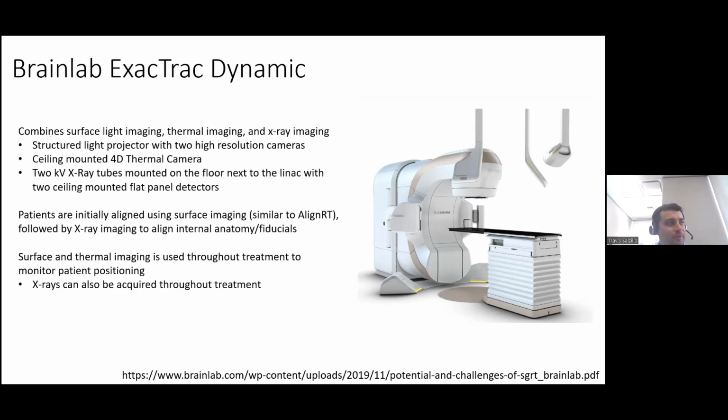There's a few other technical challenges associated with it, but that's going to be the latest and greatest in motion management. It's just not the most widespread applicable technology for motion management. The ones that we talked about today, these are ones that I feel like are very accessible and ones that can be easily implemented without too much technical prowess or experience to get it up and running.